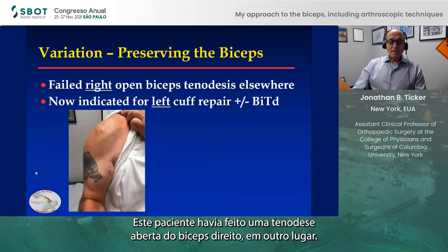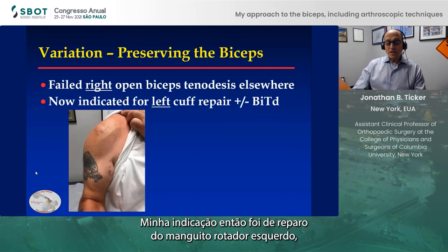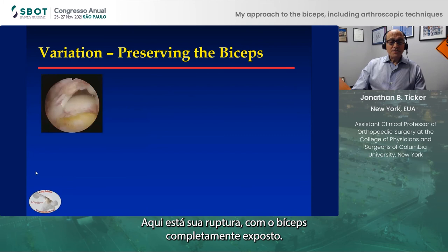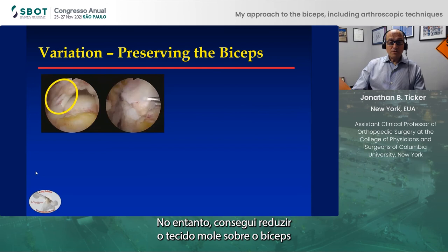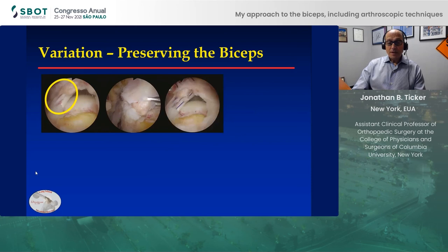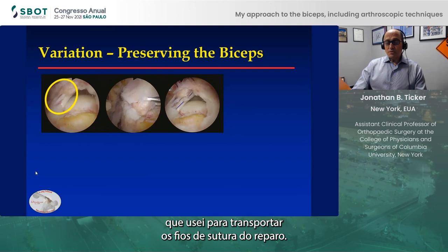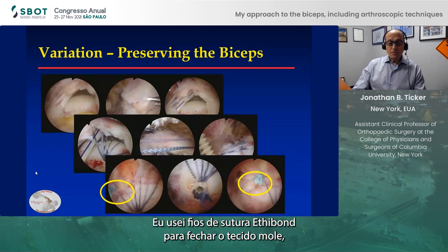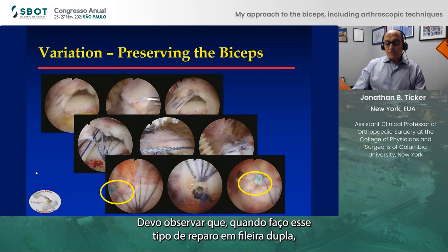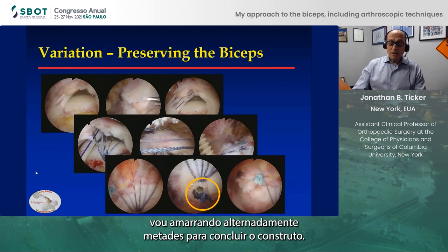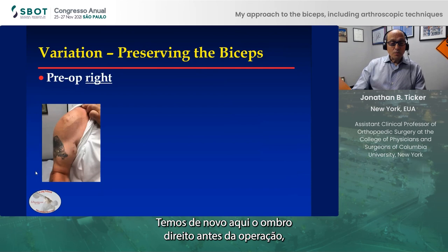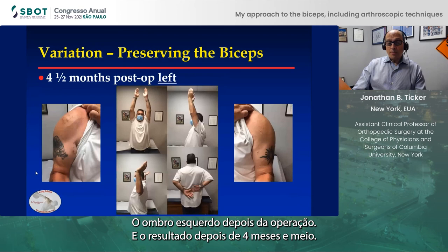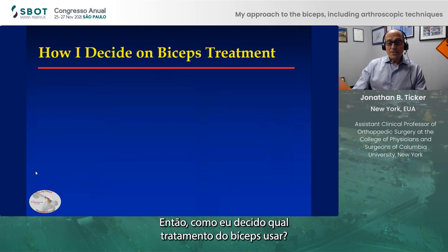In rare circumstances, you can preserve the biceps. This is a patient who had elsewhere a right open biceps tenodesis and wasn't satisfied with it. I now indicated him for a left cuff repair with the possibility of biceps surgery. Here's his tear with the biceps fully exposed. However, I was able to reduce the soft tissue over the biceps and fully reduce the cuff tear. I placed two monofilament sutures to shuttle repair sutures, proceeded with my steps for the double row repair, and here's the completed repair. I use Ethibond sutures to close the soft tissue and cover the roof of the biceps and preserve it. When doing this double row repair, if the anchor does not allow for internal locking, I'll tie alternating half hitches to complete the construct. The right shoulder preoperatively he wasn't happy with; the left shoulder postoperatively showed his outcome at four and a half months.